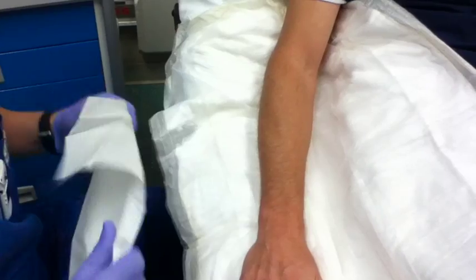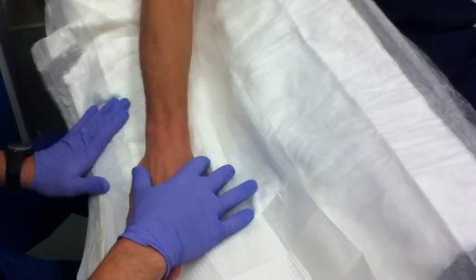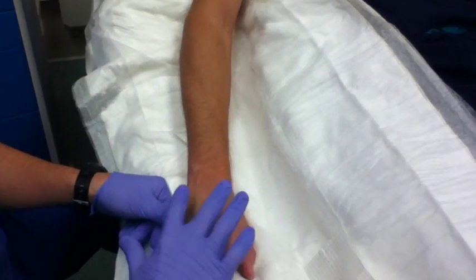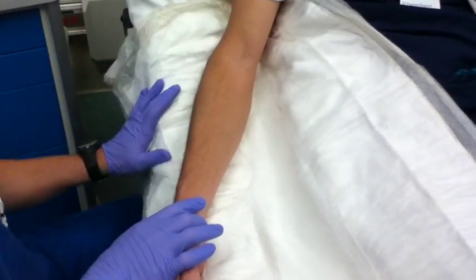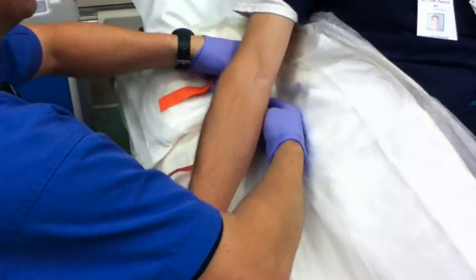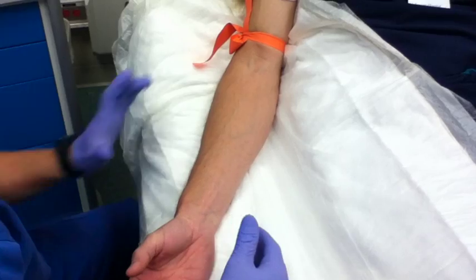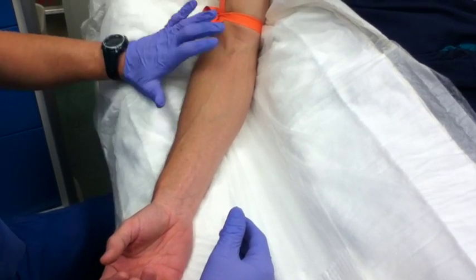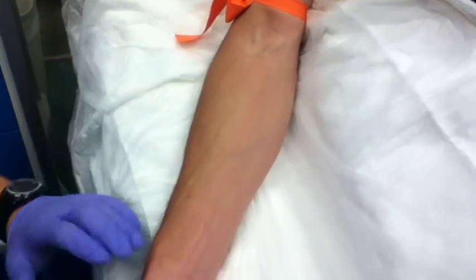For a peripheral IV, I like to find the best spot. The hand is usually the last option — they tend to be thinner with tendons in the way. I prefer the forearm if at all possible, and the AC if we know we're going to need a CT scan. Putting the tourniquet on first and allowing a moment or two for the veins to puff up and present themselves. Mid-forearms are usually very nice because they tend to be the most straight. If not, the AC is usually the one we can see and feel the best.